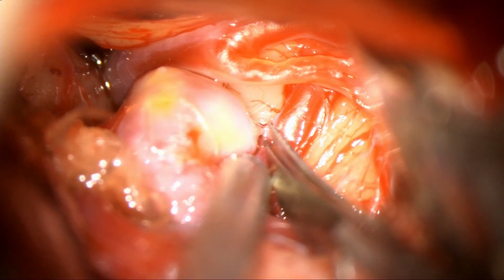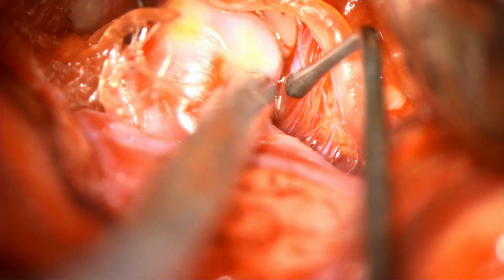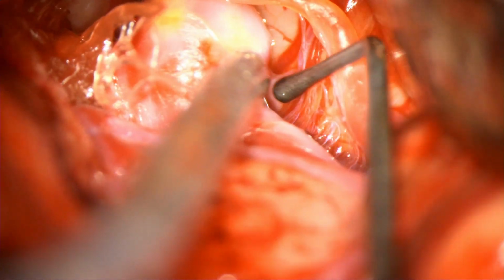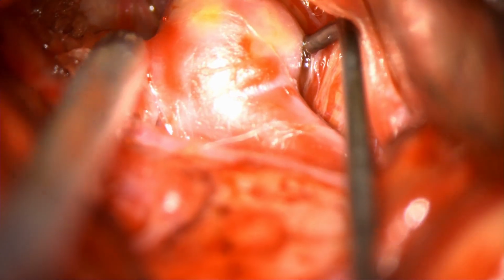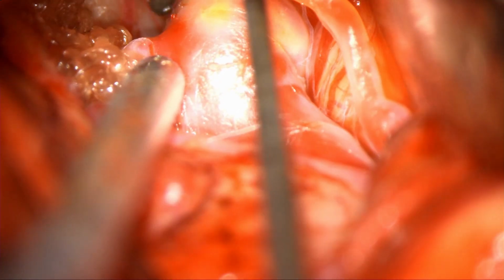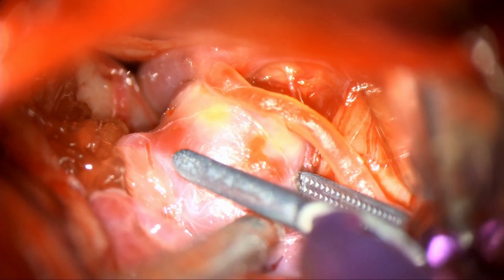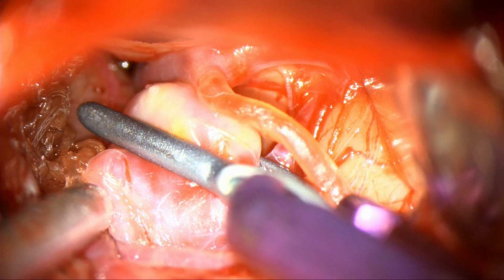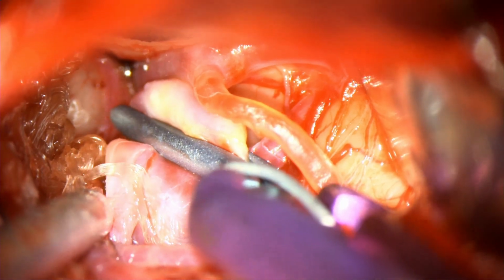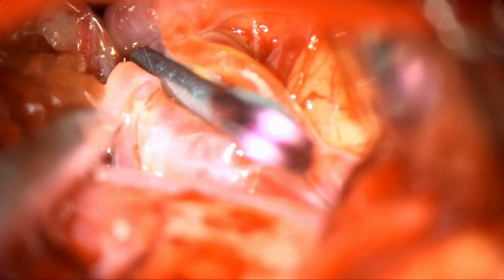The aneurysm is separated from the temporal lobe and dissected 360 to be able to pass the clip and to ensure that none of the vessels will be caught in the clip. After complete dissection, we decided to place a sideways clip and try to be in line with the bifurcation. Clipping this aneurysm across the bifurcation would be dangerous because it will cause spasm of this small frontal branch. You can already see that there is kinking.